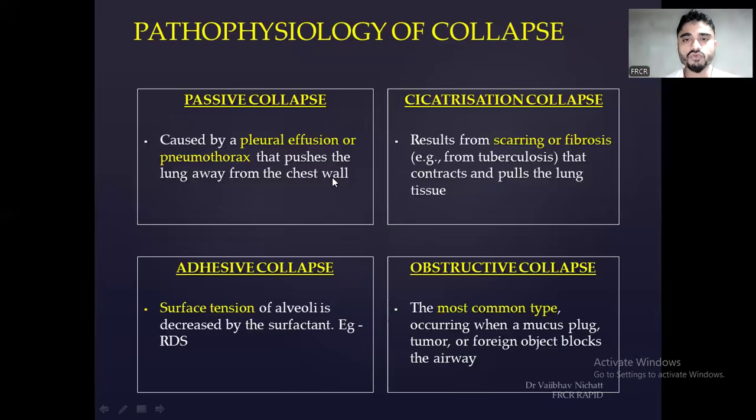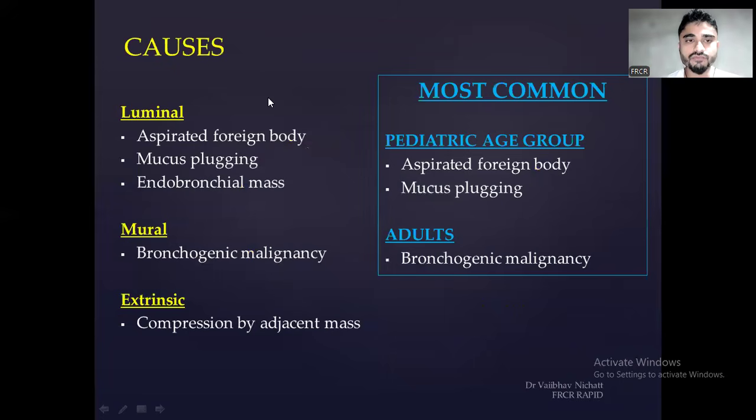So these four types of collapses you should be knowing, and if you understand this correctly, then always try to mention what kind of collapse you are dealing with in the particular CT scan or chest X-ray you are reporting. Coming to the next thing, what are the causes?